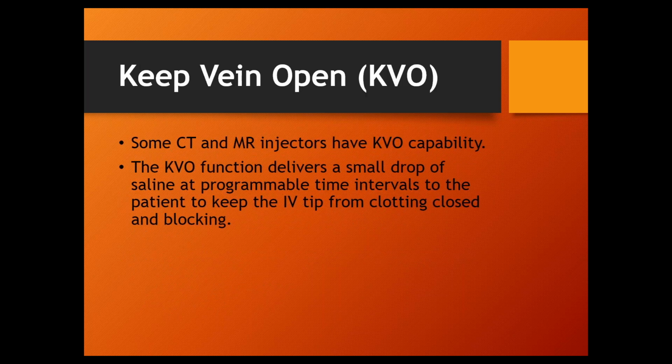All right, KVO is just what it sounds like. Well, I shouldn't say that. KVO, keep vein open. What can happen is if there's an IV needle, angio injectors don't have this function because angio injectors, that's the one with the catheter. They don't have this issue with catheters. I'm not 100% sure why, but I guess because the procedures aren't nearly as long. But this is only a CT and MRI thing with the IV needles.